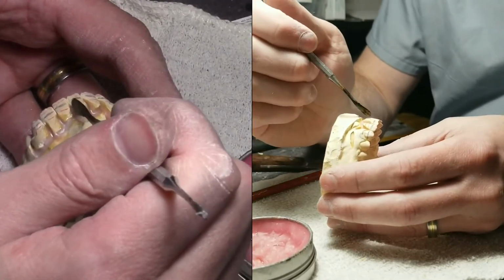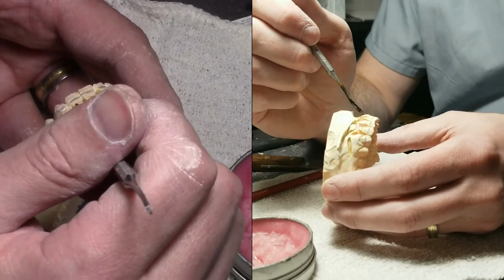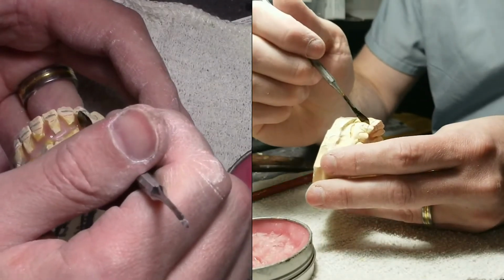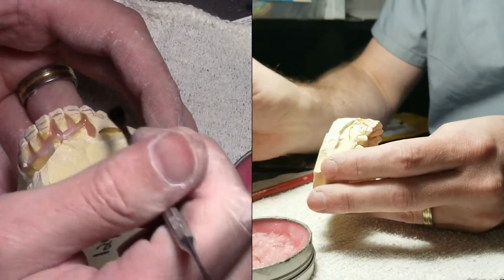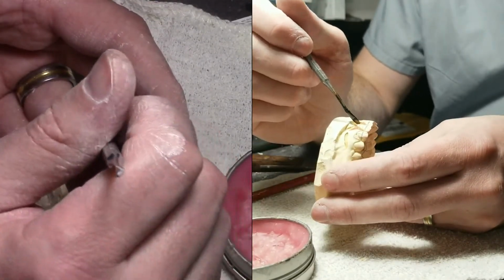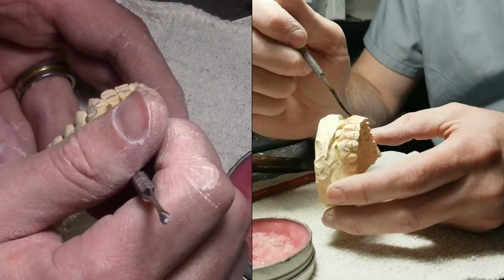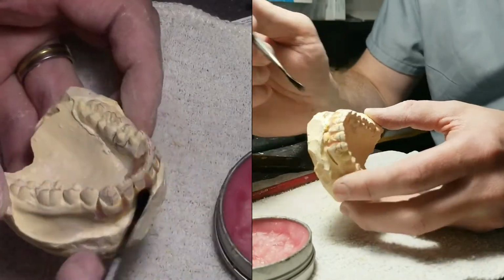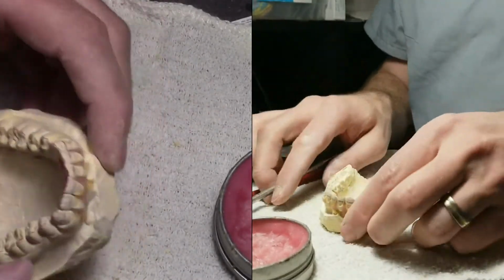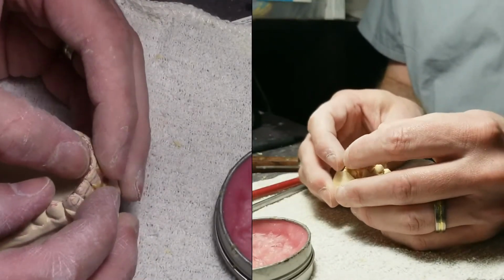Now, Jay Tyler, I don't know if he's watching, has a video of a pretty cool method where you trim it in such a way where all the teeth are slightly still attached on the lingual, and you fill in all the spaces with sticky wax, or I keep saying sticky wax, pink wax like this. And then once it's stabilized with the pink wax, you just break the teeth and rotate them slightly. I use that a lot for minor movements, or if there are special instructions, like the doctor says keep this tooth where it's at and move all the rest to match it. So I've got it pretty much filled in. I've got a little bit more filling in to do, but let me just do some final touches.